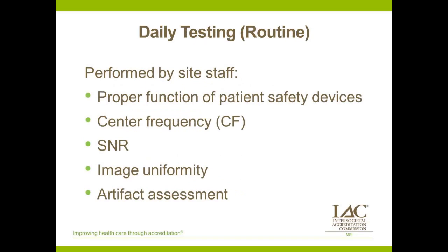Routine QC is required on a daily basis by the technical staff at the MRI facility. This must include the proper function of devices that are used for patient safety. Typically, this is going to refer to devices that are used to maintain the equipment operator's ability to see and hear the patient throughout the MRI study, as well as checking and monitoring the MRI unit's center frequency, signal-to-noise ratio, image uniformity, and an artifact assessment.